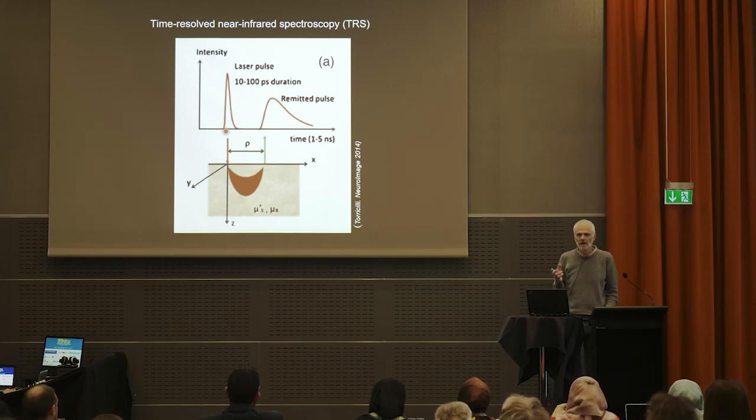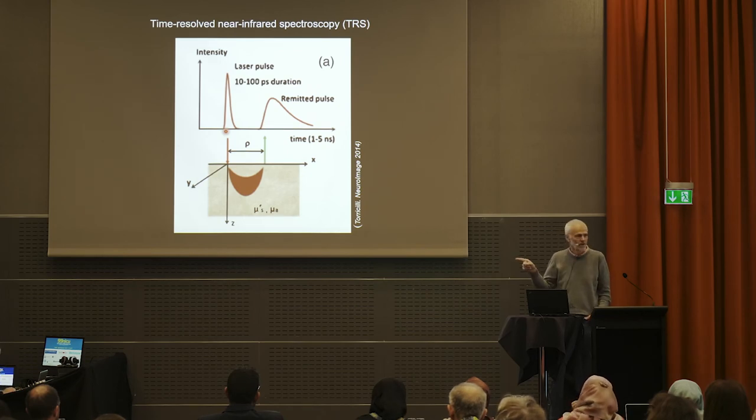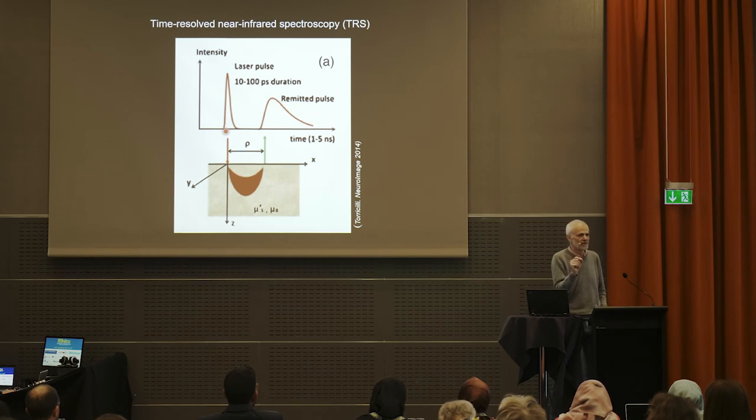If you are doing some repair works at home, you can buy in a shop a pointer which will measure the distance to that wall within a precision of a millimeter, actually using the same sort of method. It just gives a very brief pulse of light, hits the wall, gets back, and measures the time. So it's a time of flight measurement.